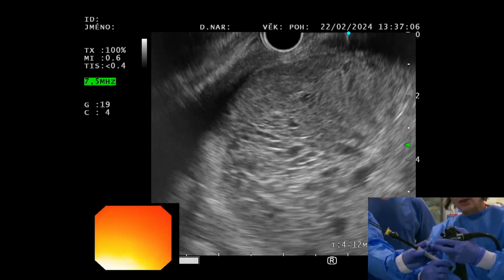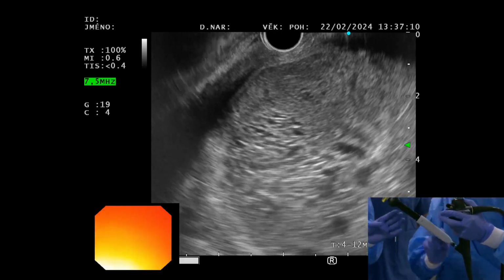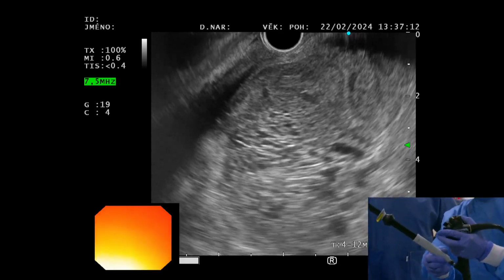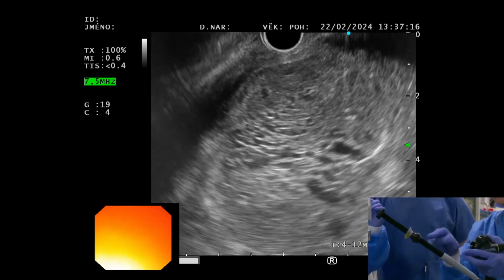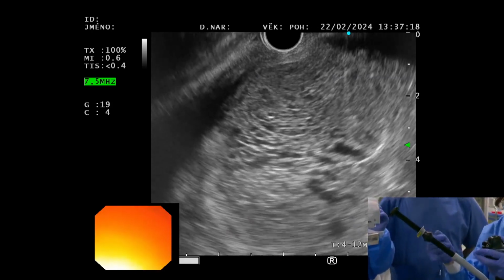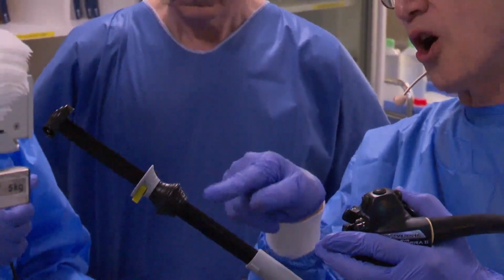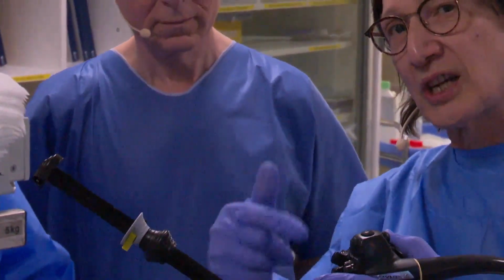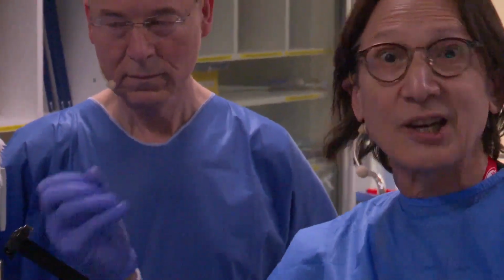And I'm in. Good. So I didn't have any resistance, and I'm going to Luer lock now. It's a swivel Luer lock, which allows me to visualize the handle, and I see there are 4 numbers, 1, 2, 3, 4. So if I get confused or flustered, I can always look at the numbers to guide me. She's not going to put this on until I tell her to make it hot.